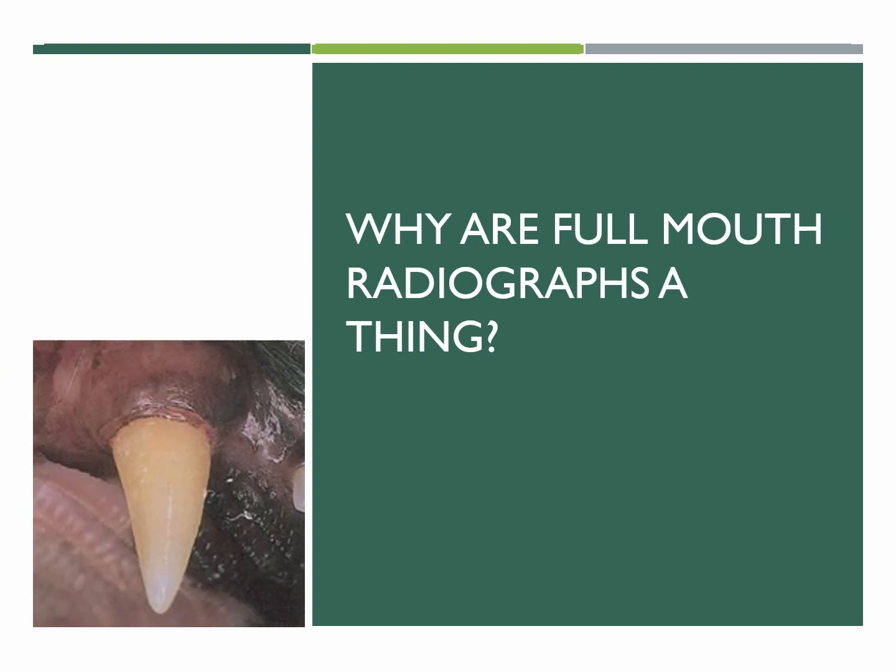You may ask yourself, why are full mouth radiographs even a thing? Back in the day, as I like to say when I like to pretend I'm old, we used to do dentals, but dentals were more symptomatic of a problem. So an animal had a broken tooth, or there was a rank smell, or there was something going on.